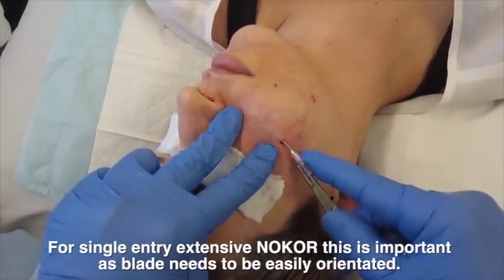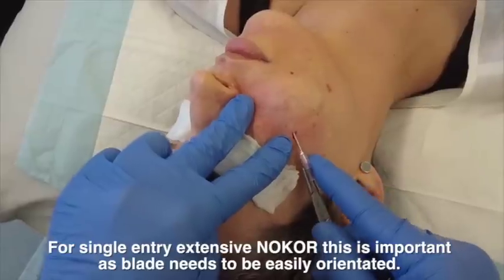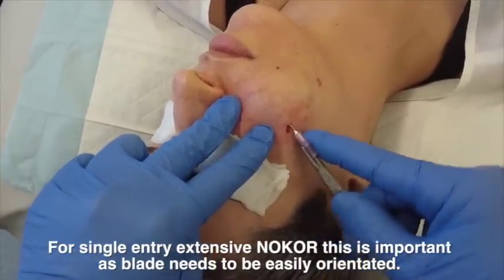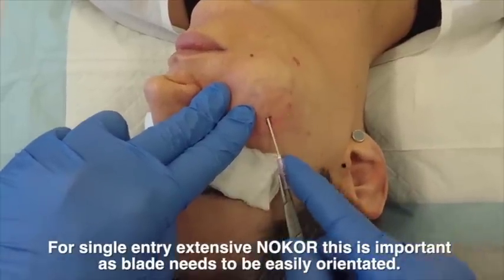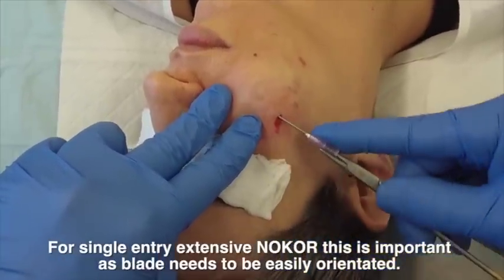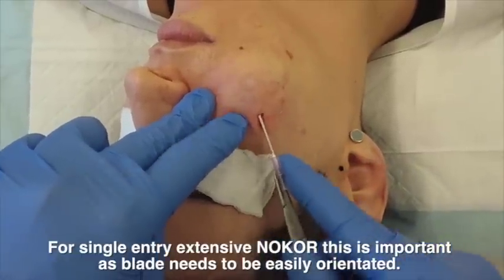The downside is that I don't have as great a feel. I like to actually feel my needle to know what resistance I'm having. With this method, the more extensively you perform the no-core, the more extensive the bruising and, once again, the hematoma rate.